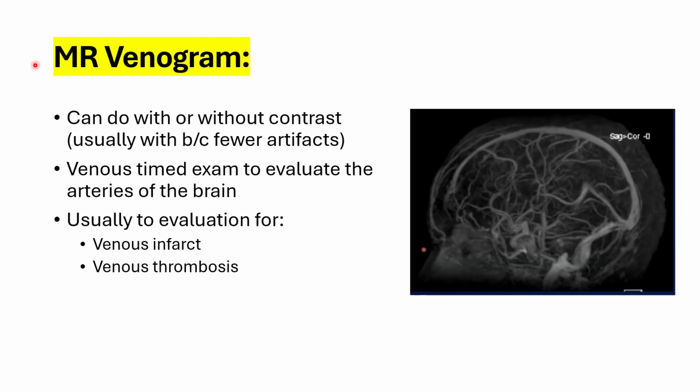Lastly, we'll talk about MR venogram. This can be used with or without contrast. However, with is usually better because it allows for fewer artifacts. This is venous timed, and it's really good for evaluation of venous infarcts and venous thrombosis.